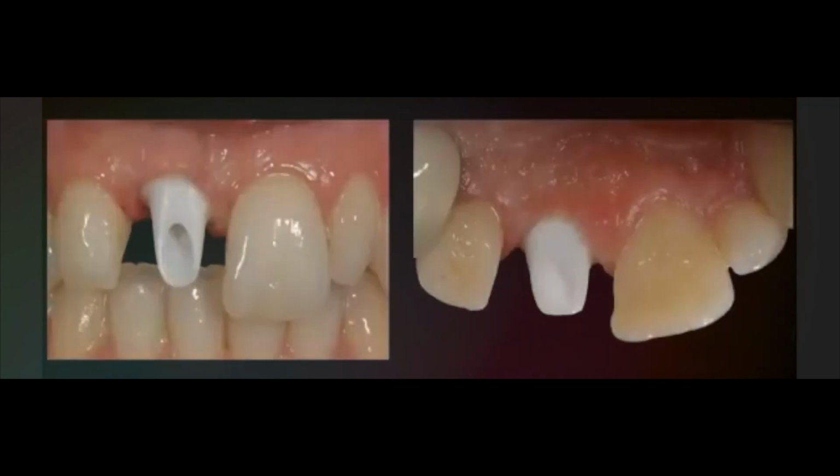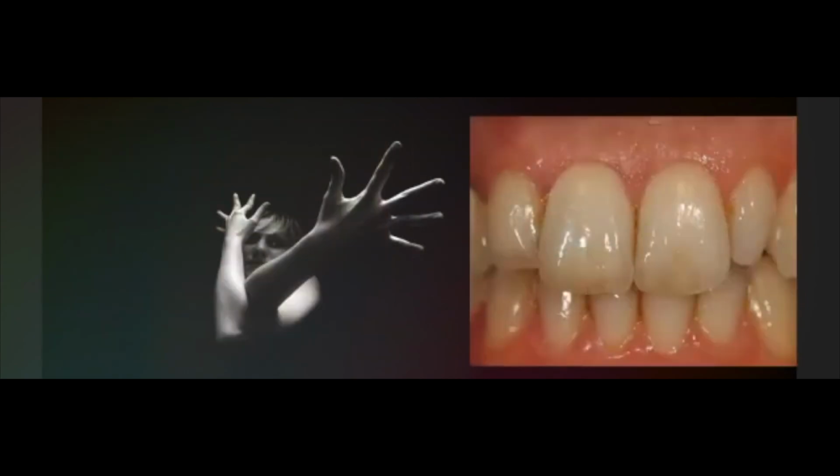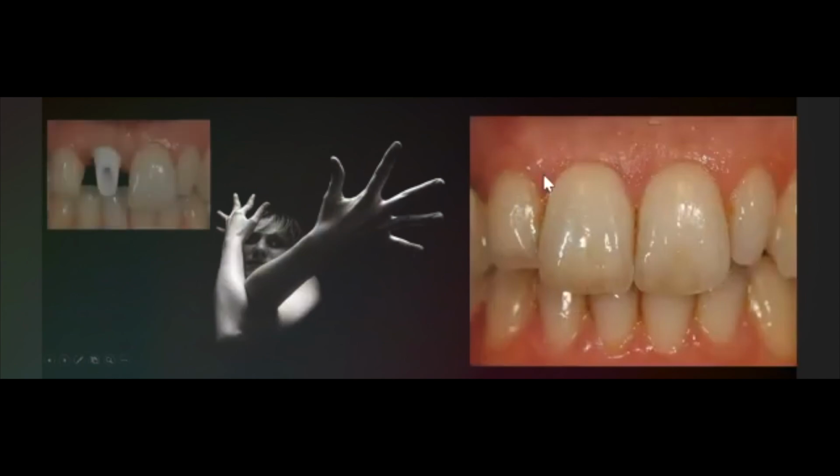And of course, when we have ceramic or whatever abutments, it's good to make a try-in in the patient's mouth in order to see if it is a good fit and there is good support to the subgingival peri-implant part, because the pink aesthetic is very important as well, and the condition of the peri-implant soft tissue is very important.